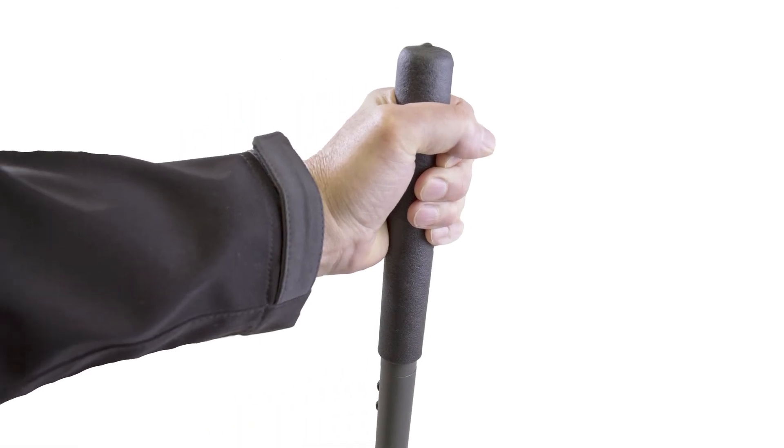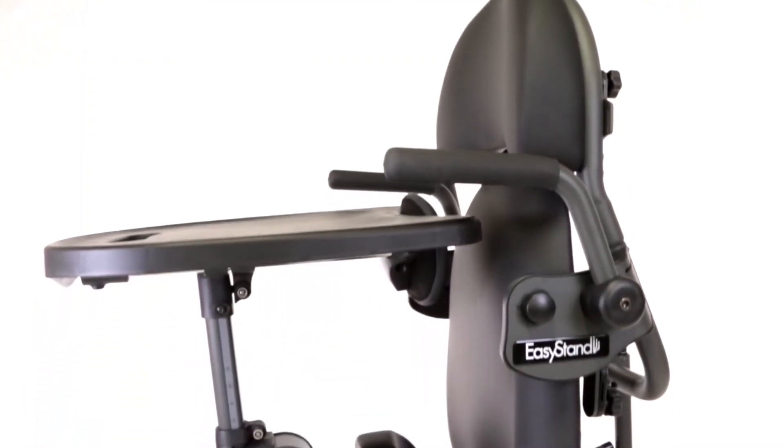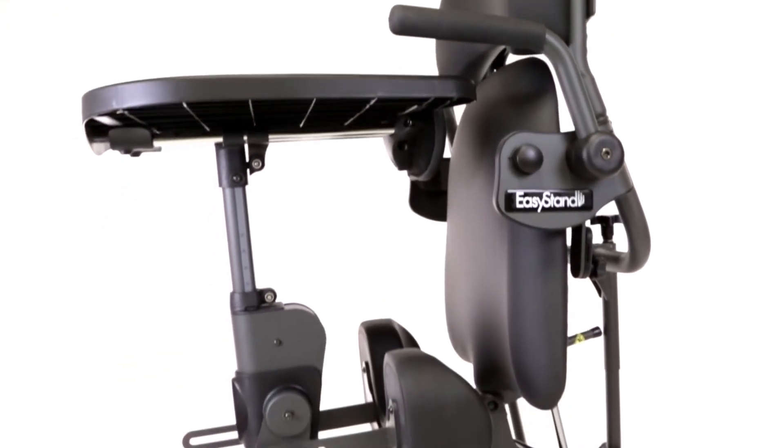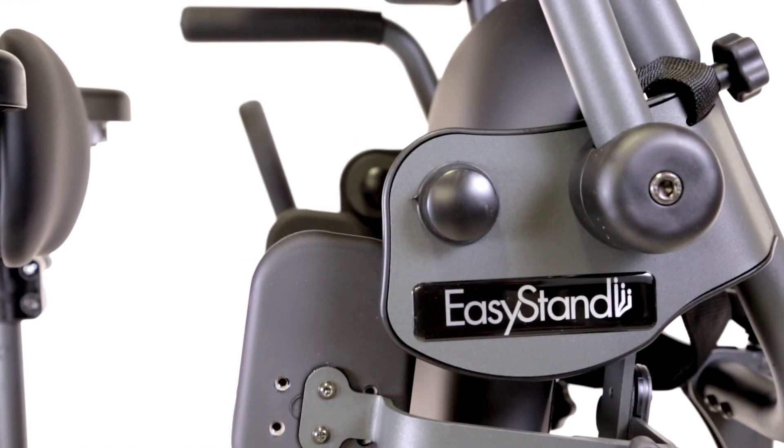The user can independently achieve the standing position with the manual hydraulic actuator, or the optional push-button power uplift. The Easy Stand Evolve is the most innovative stander available. Request a free demo at EasyStand.com.